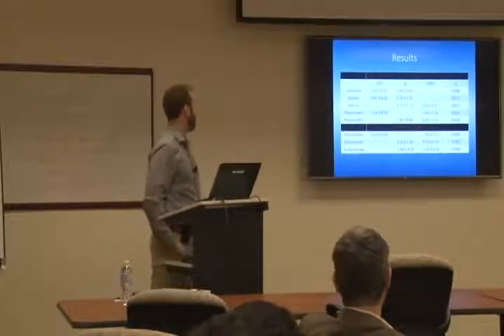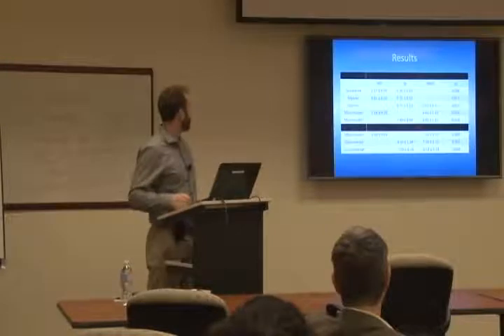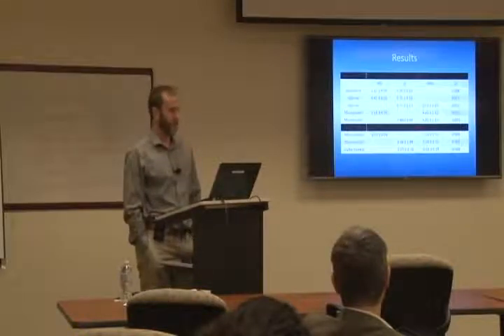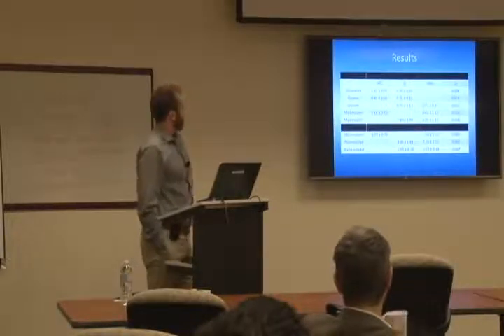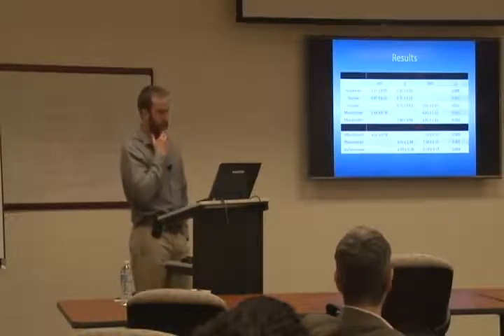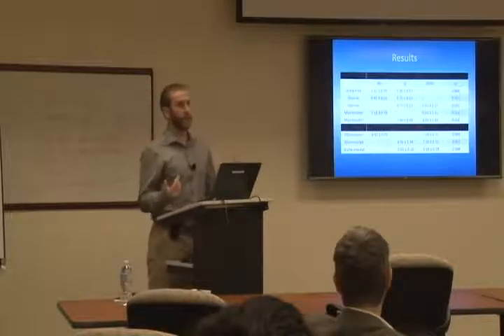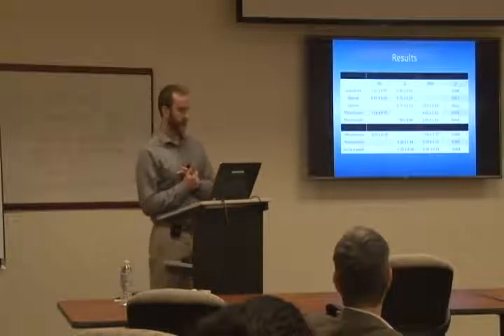In the anterior cingulate and the thalamus, it's kind of a tough graph to read, and the laser pointer isn't working, unfortunately. But we saw consistently decreased myoinositol in the major depressive disorder group relative to the healthy control and schizophrenic group. The reason I find that interesting is because in bipolar, one of the treatments is lithium to reduce mania, and one of the ways that works is it acts on reducing myoinositol. Myoinositol is kind of a catch-all metabolite. It's involved in a ton of functions. It's a big osmolyte. But this is in major depressive disorder.